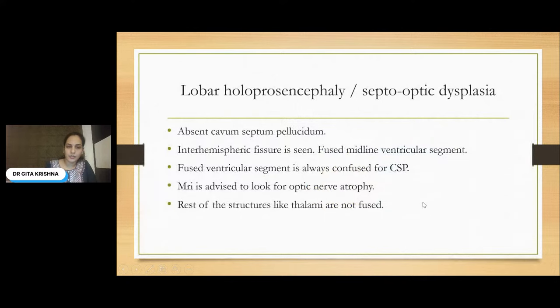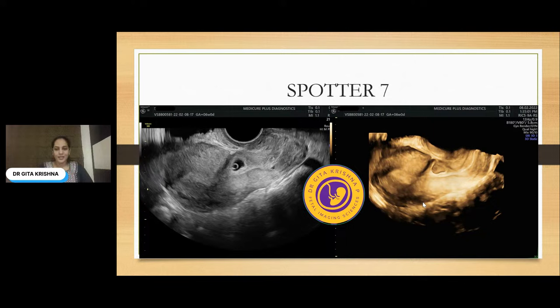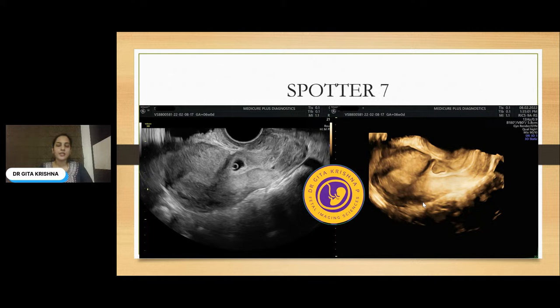We will go to the next slide, spotter 7. This is one of my closest cousin's cases. She came in with spotting — this is a 2D as well as 3D image acquired. She had a previous history of caesarean section, and I was able to see a small cyst-like structure within the scar region. What is your diagnosis here?